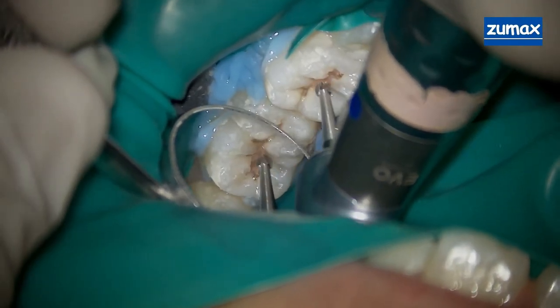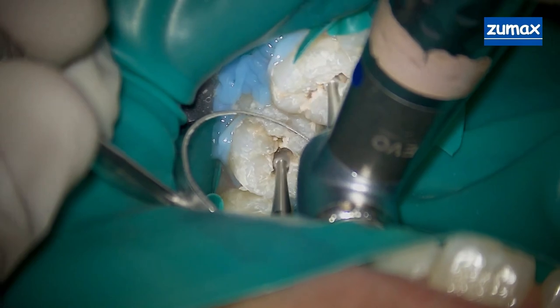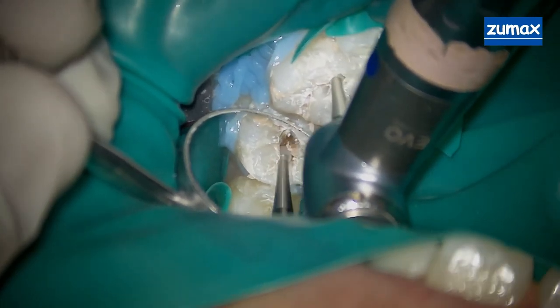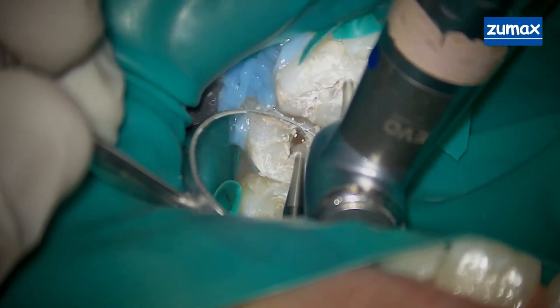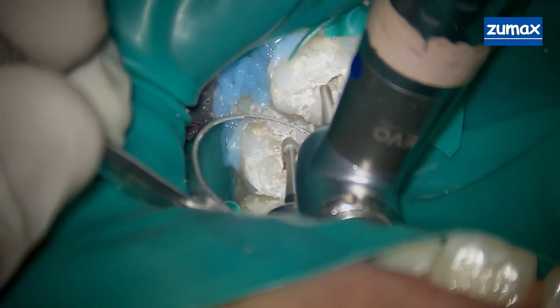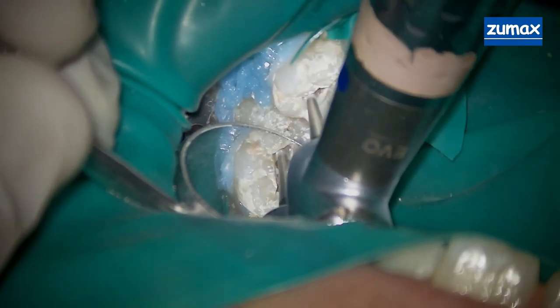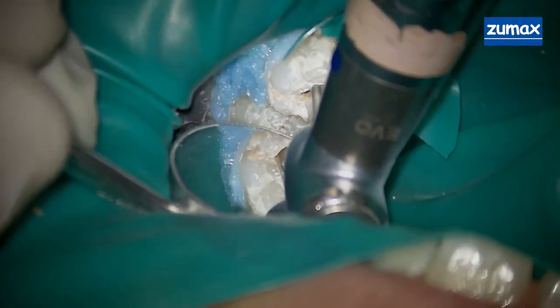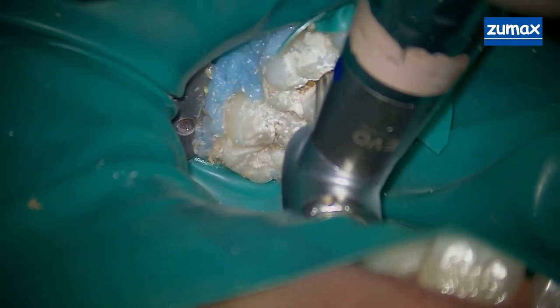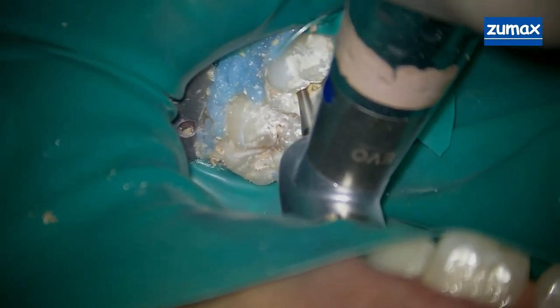You'll see the tooth here — you can see the occlusal caries, they are very extensive. At this point we're removing the caries, and we want to make sure that those are completely removed until we reach the point where the caries either reach the pulp chamber, or we have that exposure and remove all of the caries.